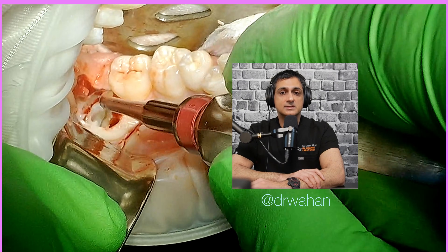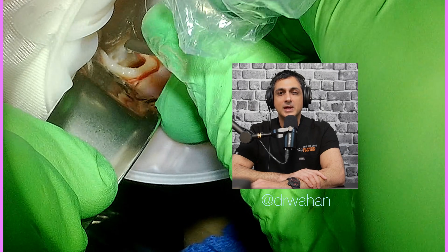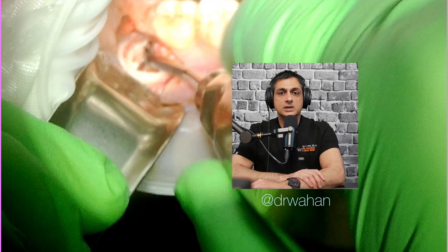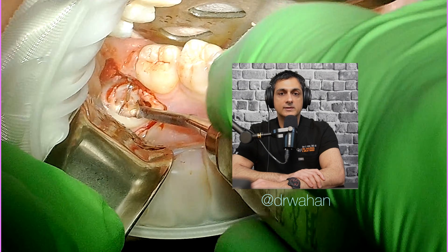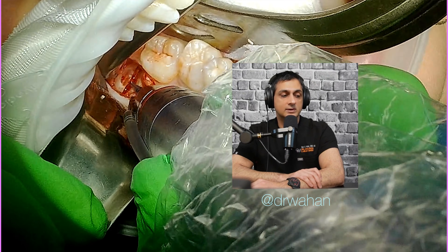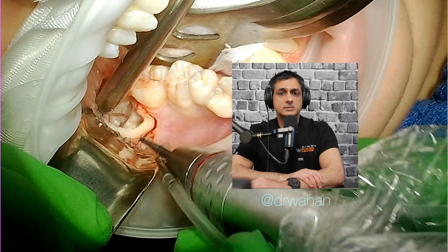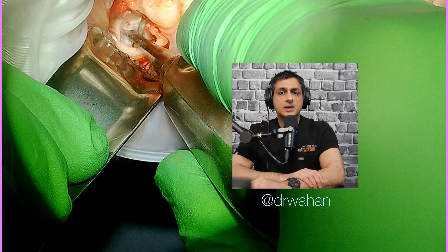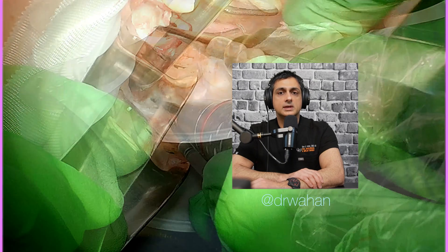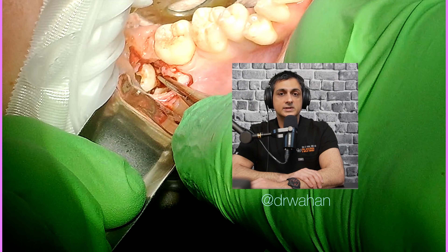This is an interesting case — this wisdom tooth had four roots; normally they have two. Two or three of those roots were right over the inferior alveolar nerve, so you'll see me working around the nerve carefully. I've switched to a 701 long bur, which is thinner, and I split the distal root and am now taking it out in a couple of segments, then working on the other roots — elevating them enough to remove with a hemostat.